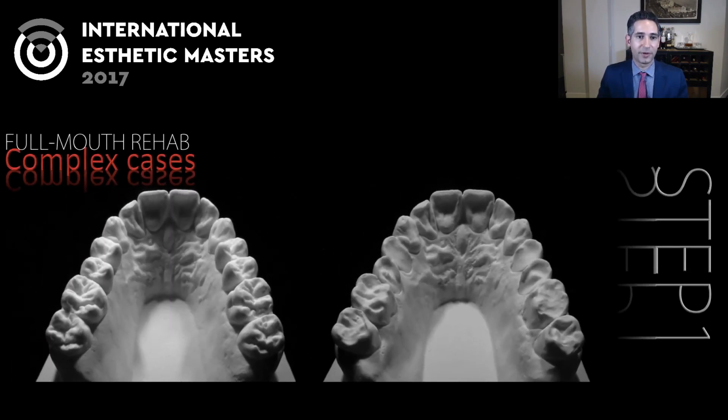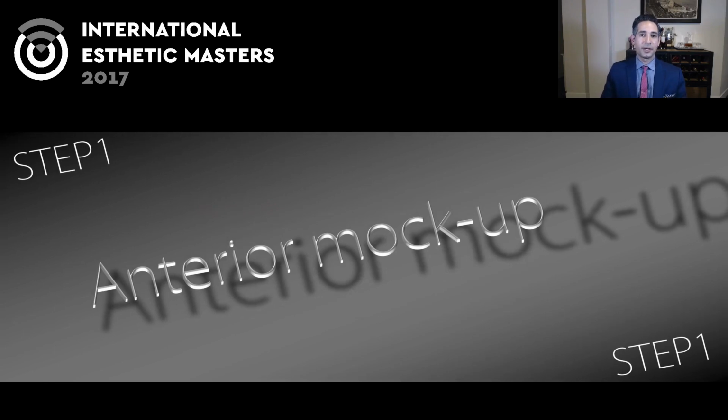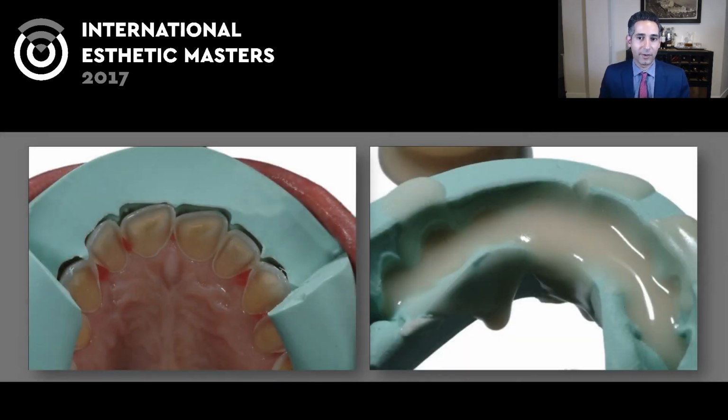So step one, as before, is to test the aesthetics, and I call that the anterior mock-up. And how that works is we have our wax up and we take a silicone putty of that, and in this picture on the left, what we're looking at is two things. We're looking at how much space we have, because when you want to do this mock-up, you have to have space. So as long as it's additive, which means that you're adding volume, you can do that. And in most cases, that's not a problem. Obviously, there's exceptions to that, but most of the time we can go slightly bulkier for now if we have to, with the idea that as long as we have a little bit of space, we can test this out and make sure that the outcome is going to be something that meets the patient and our expectations.